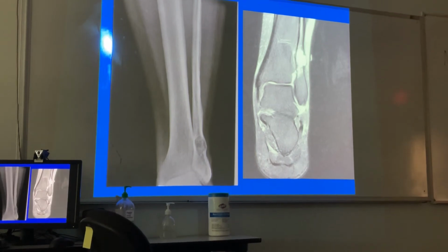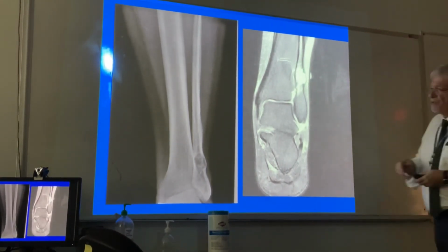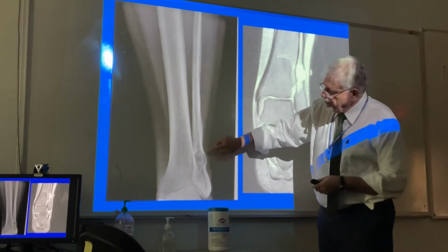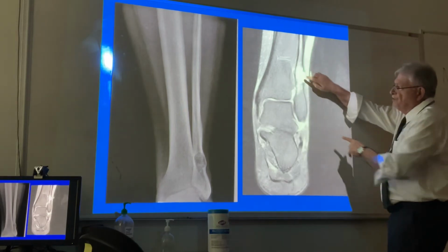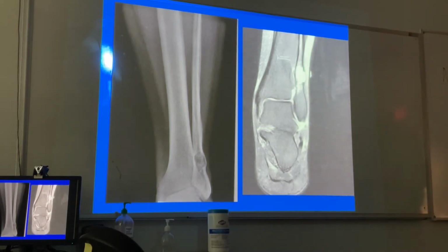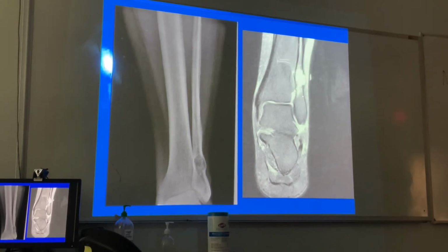There's a radiolucency. The radiolucency just shows that it's like a hot spot. It's the area. What I'm asking is, is this about the same size as what you think you see on the MRI? Yes. Okay, it can either be the same, or I'm going to argue that maybe there's a little bit of inferior extension here, right? That's why the orthopedist needs it.